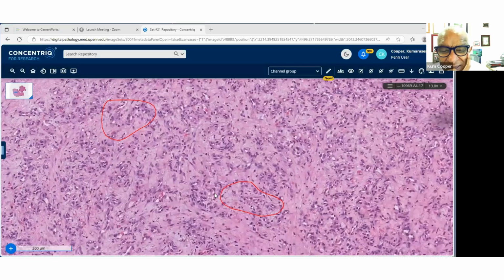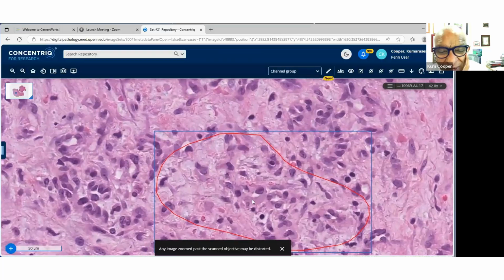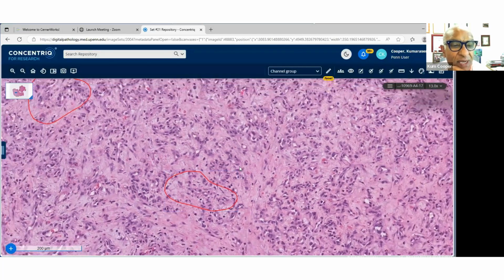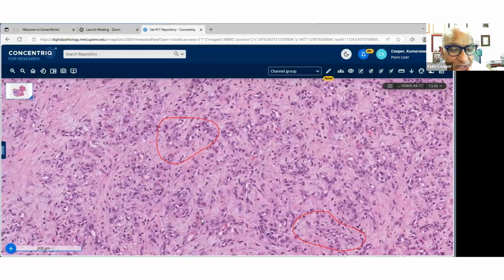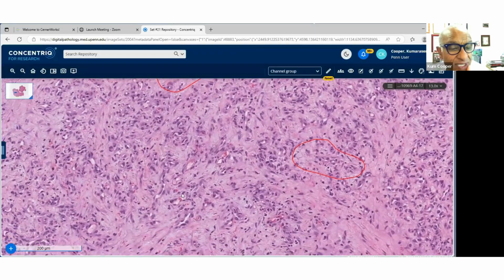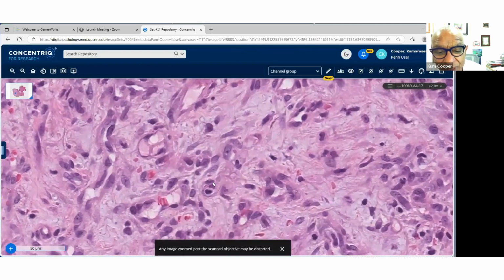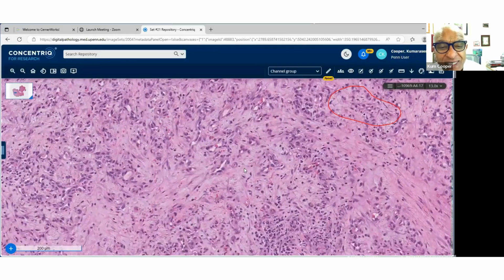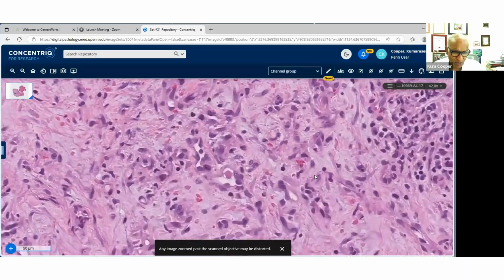So some of these looked epithelioid, and that's the reason these are marked out. They do look epithelioid, which bacillary angiomatosis typically does, and pleomorphic. Endothelial nuclei are pleomorphic. Although in parts, I wondered whether I'd seen eosinophilic material in the lumen, and you sometimes see that eosinophilic detritus in the lumen of, oh, there's a nice one here. There may be a little bit of fibrinous material here as well in the setting of bacillary angiomatosis.